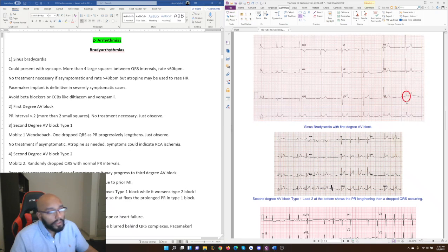This portion right there. So you can see that QRS complex is slightly off the baseline, right? You can see this weird, almost ST elevation type of thing happening, and that's happening because there's a P wave happening at the same time as the QRS is coming to an end, thereby elevating it. Usually the P wave is supposed to occur before, but it didn't really. There's no good P wave here. So the P wave is kind of not happening regularly with the QRS complexes.